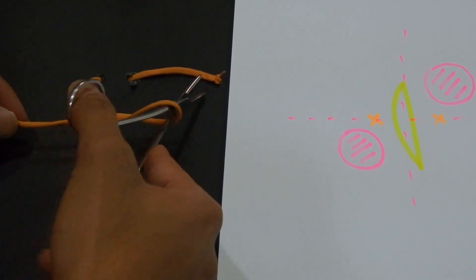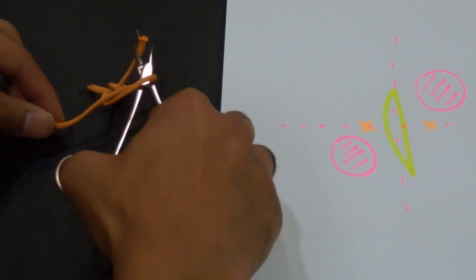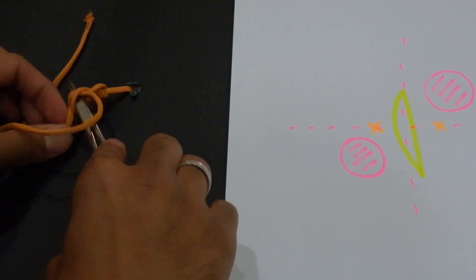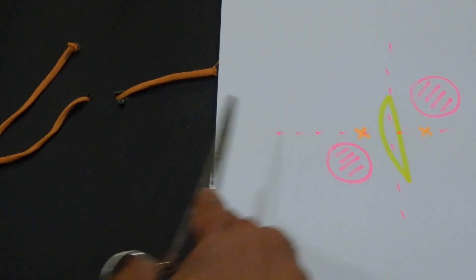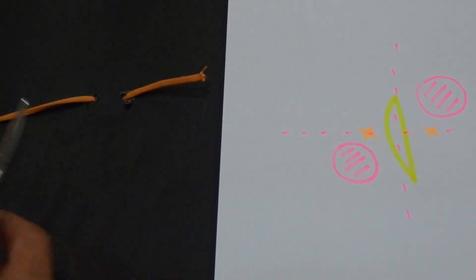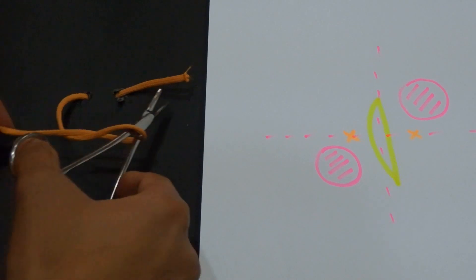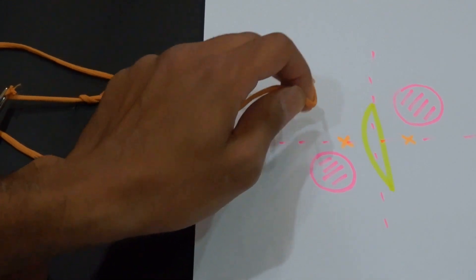I have to bring it toward this side, then the second one toward that corner, then I will continue — one toward this and again toward that corner. My target is to change the direction of the knot to make it square by bringing it toward this corner and then toward that corner. The second principle is never to cross your hands — that's why we choose this side and that side. If we bring it toward the other side, we will cross our hands, which is really bad for a surgeon.